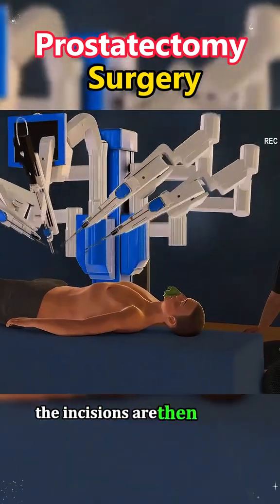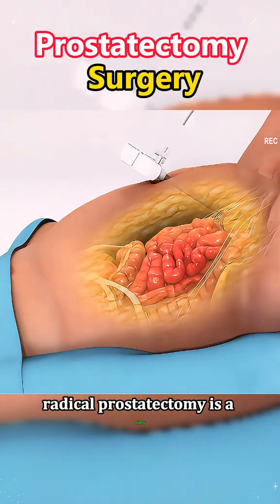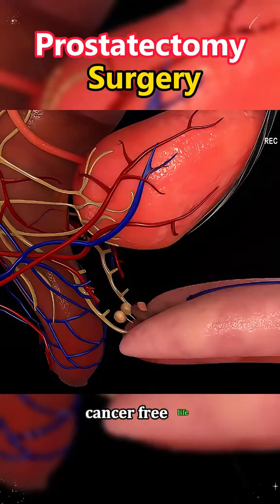The incisions are then closed, and the patient is moved to the recovery room. Radical prostatectomy is a highly effective treatment for localized prostate cancer, offering patients a second chance at a healthy, cancer-free life.